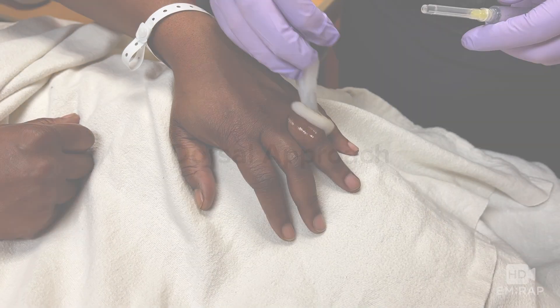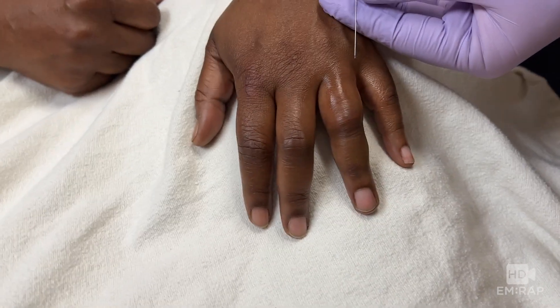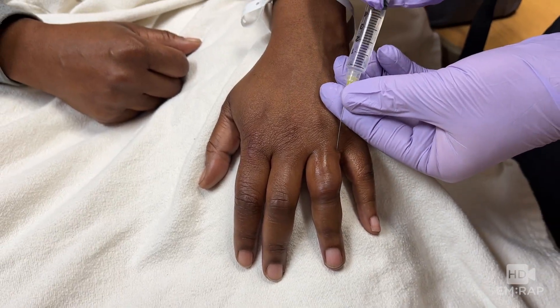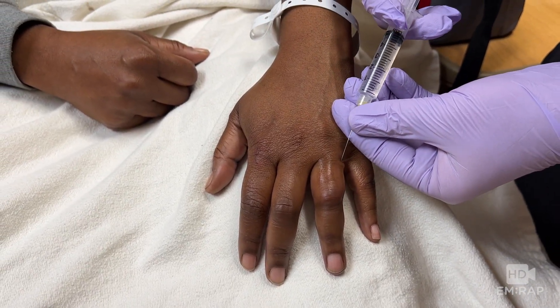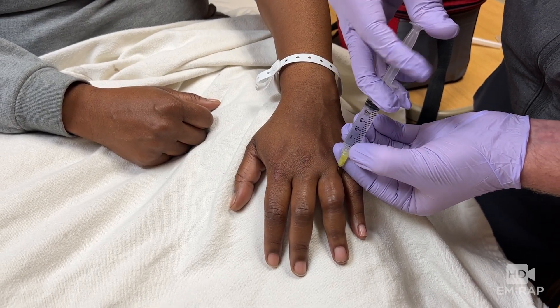For the dorsal approach to a digital nerve block, we're always going to start by prepping the skin. Position the patient with their palm downward, and insert the needle at the dorsal web space. Advance the needle until it reaches the palmar aspect of the hand, but does not exit the palmar skin.